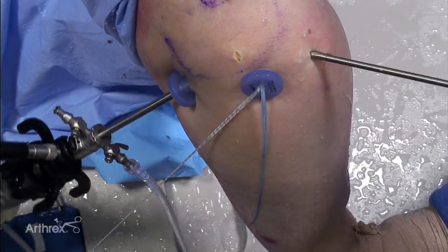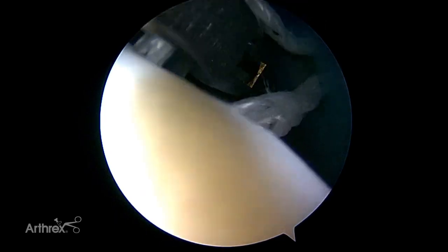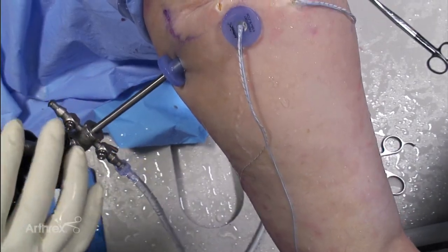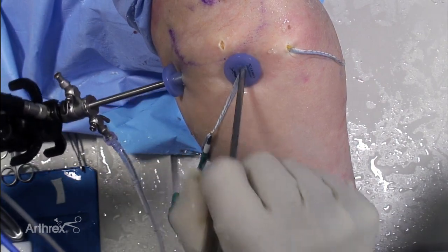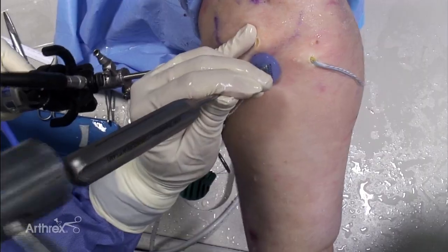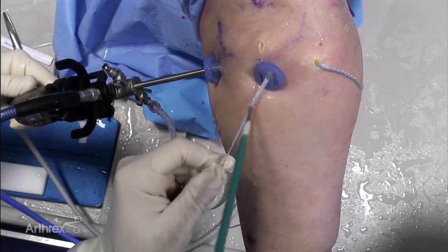Trim the fiber tape loop at the splice to separate the tails. Retrieve one fiber tape from each of the medial anchors out an accessory portal. Pre-load the fiber tapes into the swivel lock. Prepare a lateral bone socket.